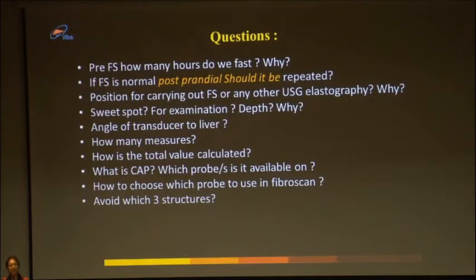Okay. How is the total value calculated? How do you calculate it? What is the statistical measure that you take? It's not the mean. It's the median. Yes, it always has to be the median. Whether you take ultrasound elastography or you take Fibroscan, it's always the median value with the standard deviation.